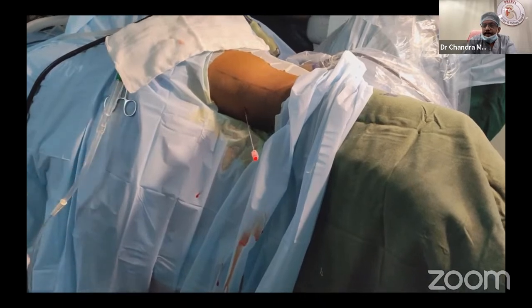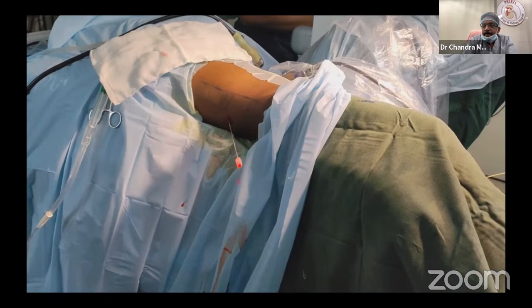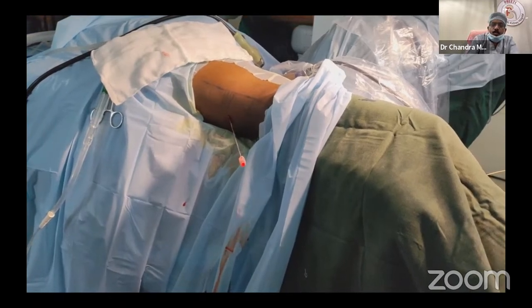First we will observe for some time because it's in the periphery only. If any puncture has blood, it is not a good puncture, but in any kidney, if it goes through the parenchyma, some amount of blood can occur. Watch for increased darkness, or if you flush, it should dilute. If the needle is crossing the infundibulum, do not dilate.